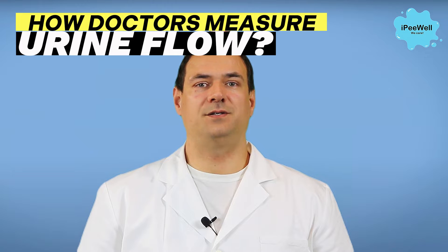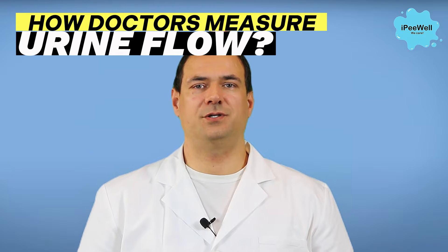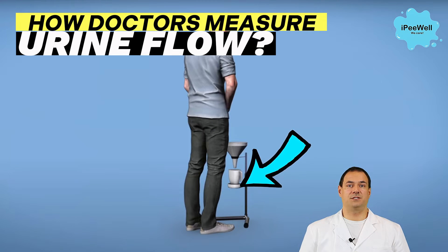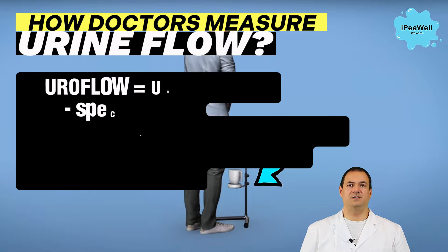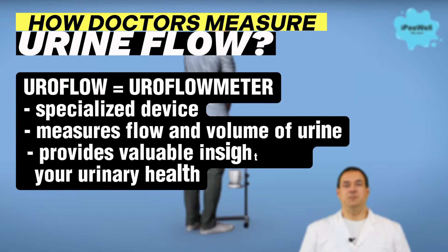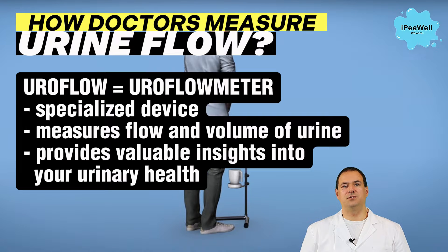Have you ever wondered how doctors measure the flow of urine during urination? That's where uroflometers come into play. A uroflometer is a specialized device designed to measure the volume and flow rate of urine. It provides valuable insights into various urinary tract problems, such as urinary obstruction, overactive bladder, and prostate issues.